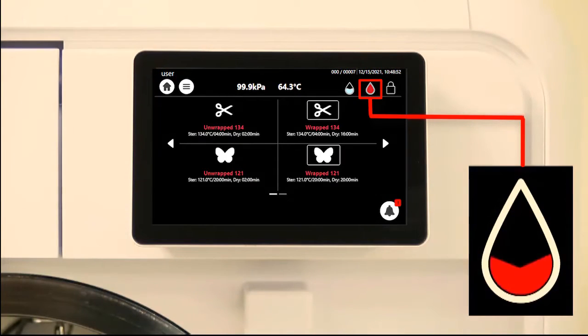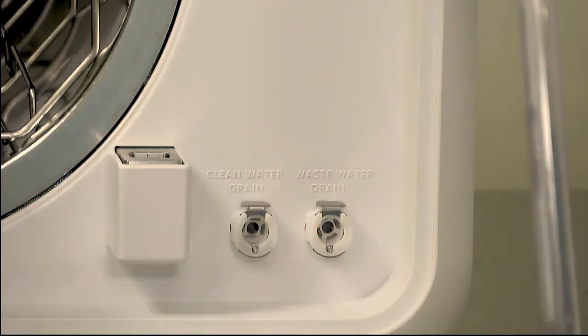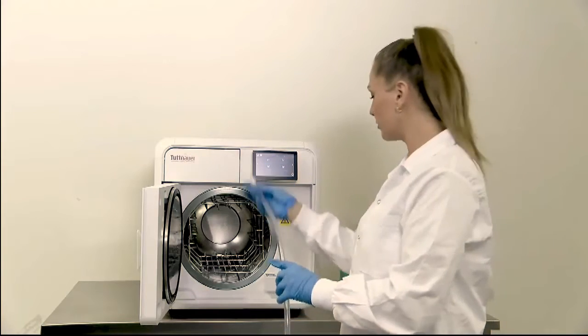When the water tank icon is indicated red, empty the wastewater tank using the front drain port.